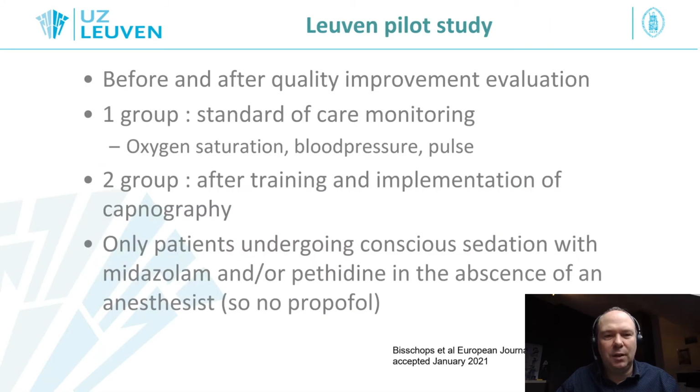So in our pilot study, to address this question that we were faced with for the introduction of a sedation protocol, we did a before and after quality improvement evaluation, where in the first group we applied standard of care monitoring, and in the second group, after training in sedation and implementation of capnography, we assessed a different group of patients. Note that we only use this for patients undergoing conscious sedation with midazolam and/or pethidine in the absence of an anesthetist, because then we always use propofol and capnography is always present.